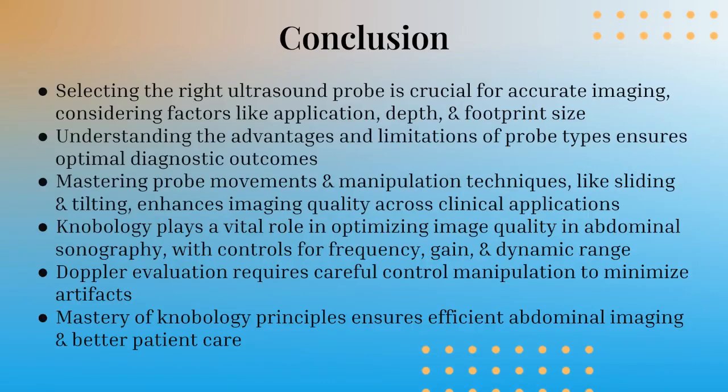So in conclusion, selecting the right ultrasound probe is crucial for accurate imaging, considering factors like application, depth, and footprint size. Understanding the advantages and limitations of probe types ensures optimal diagnostic outcomes. Mastering probe movements and manipulation techniques like sliding and tilting enhances imaging quality across clinical applications.